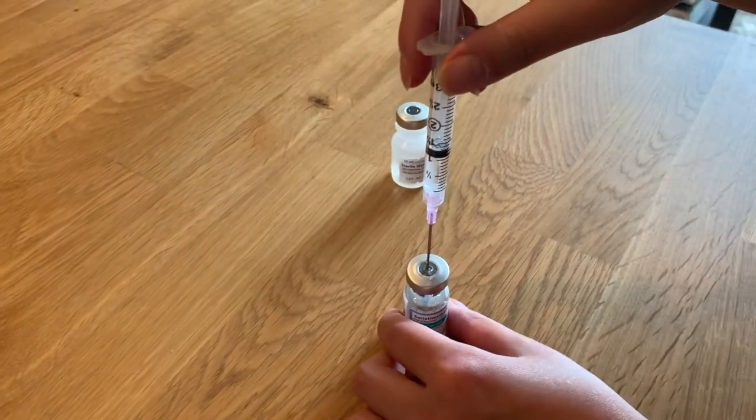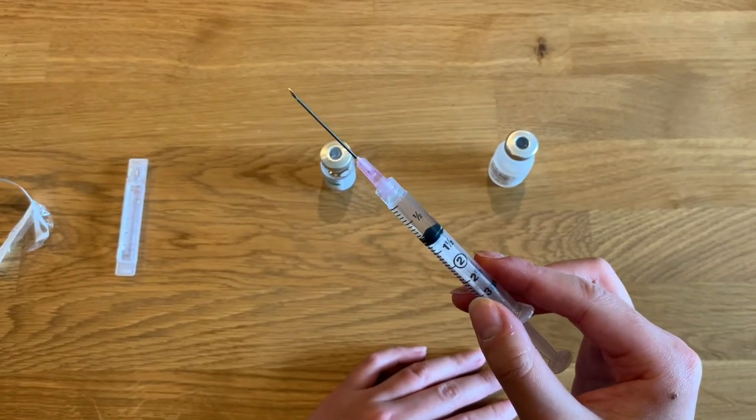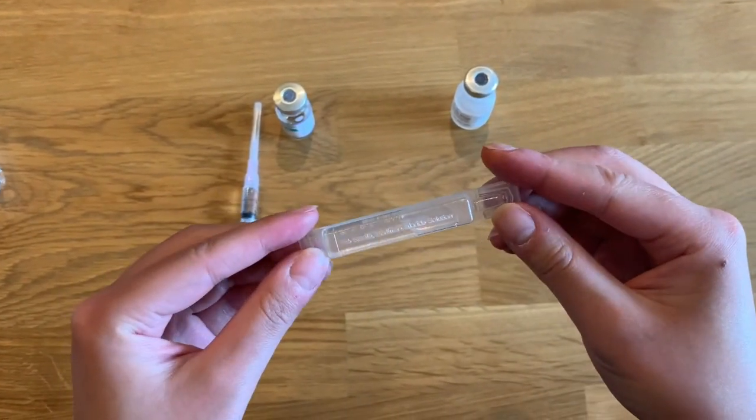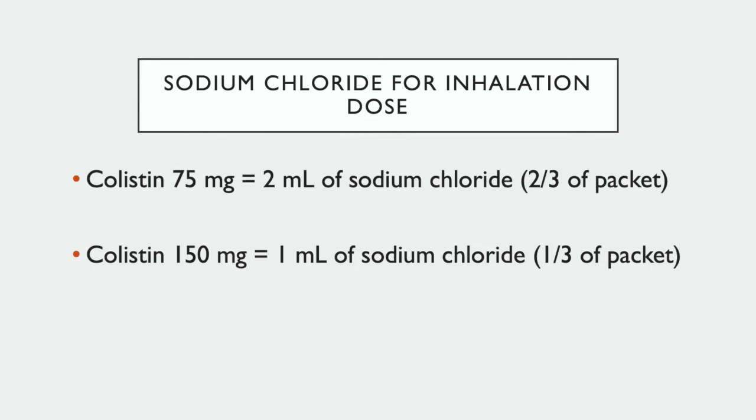Put the vial back on the tabletop and remove the syringe from the vial. You now have your dose. Inject this dose into your nebulizer cup. Then take your sodium chloride for inhalation unit dose packet and open the top. If your colistin dose is 75 milligrams, pour 2 milliliters of sodium chloride for inhalation into your nebulizer cup. If your colistin dose is 150 milligrams, pour 1 milliliter into the cup. You will now have a total of 3 milliliters in the cup. Discard the remaining packet.